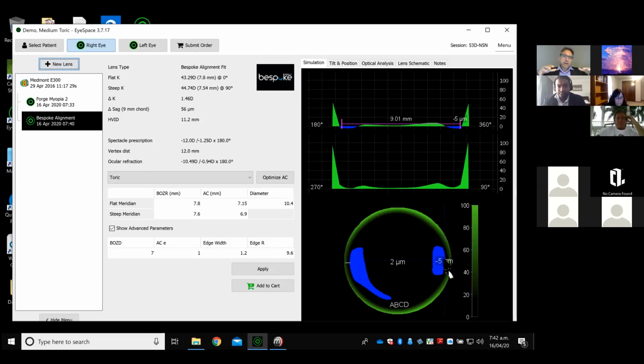So because we're fitting the weight, the bearing, into the alignment curve to the periphery, we're spreading all the way to the periphery and not applying weight or pressure on the center of the cornea. And therefore, the lens can be larger and we don't get those adherence forces that we typically get with these big optic zones. So the advantage of the larger lens is that it stabilizes better, it tucks better underneath the top and bottom lid, but specifically the top lid, and so there's a bit of improvement in comfort.